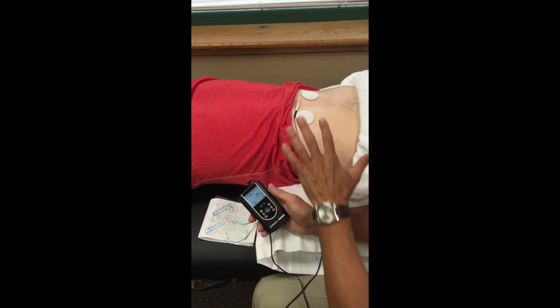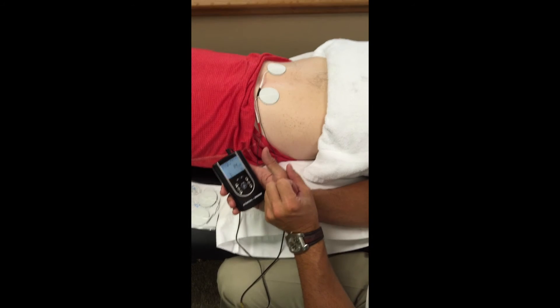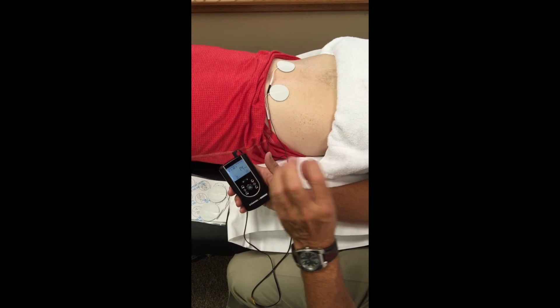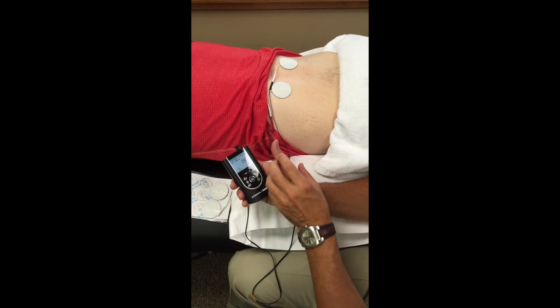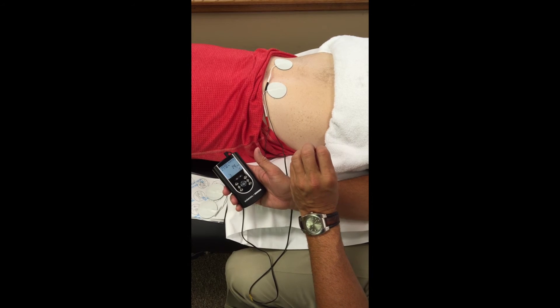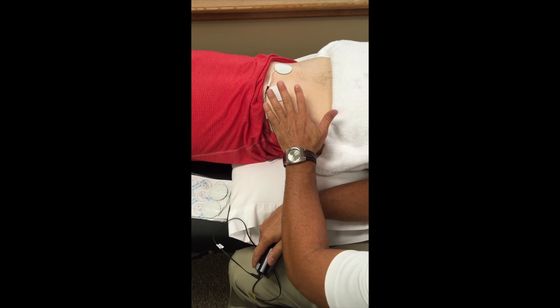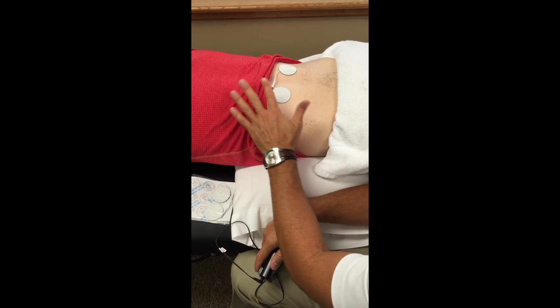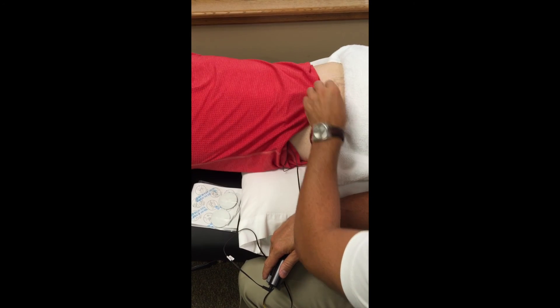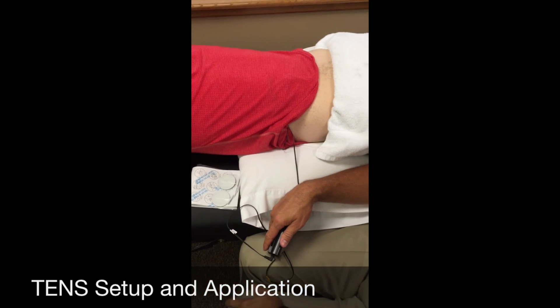If we look at the tissue, most of the time — unless I'm trying to control edema or I'm in a real chronic situation where noxious stimulation is required — I really don't want the muscle tissues jumping around and twitching and fasciculating. So in that situation he's on at a comfortable level but strong. We can combine this with another modality, then let him comfortably rest, and I'm going to check in with him every couple of minutes and give him a call light or a bell.